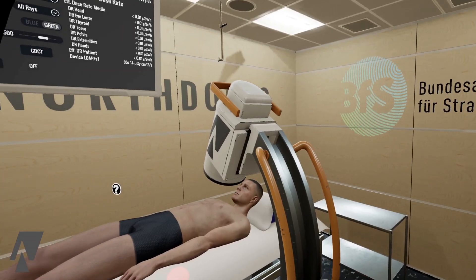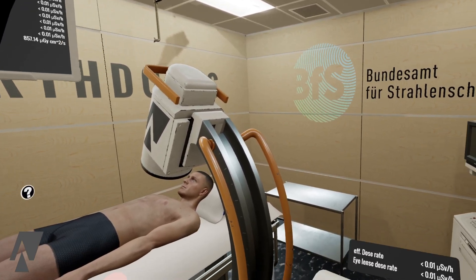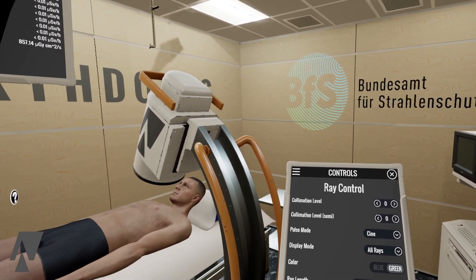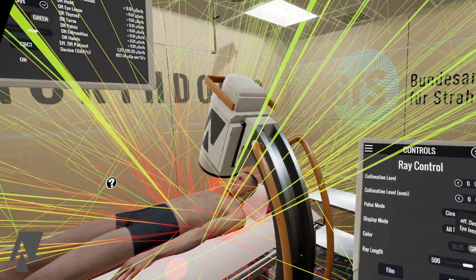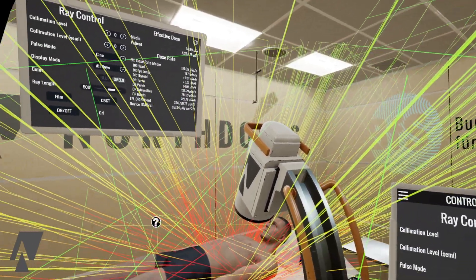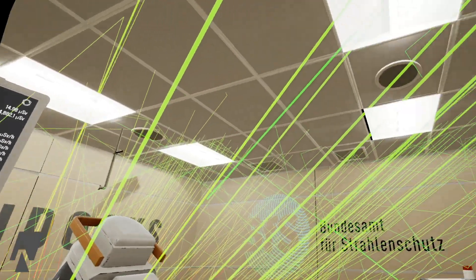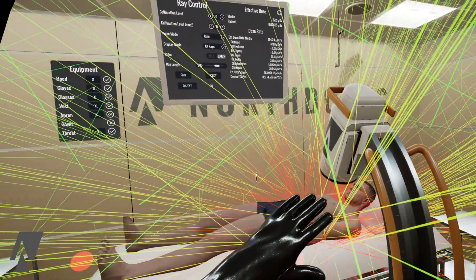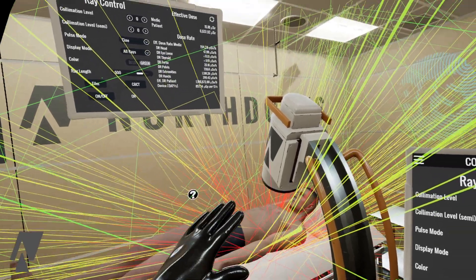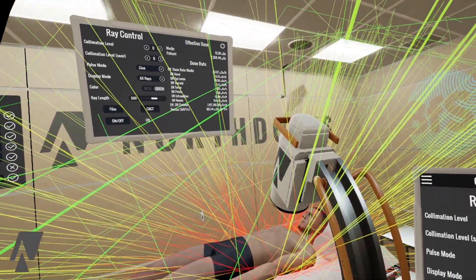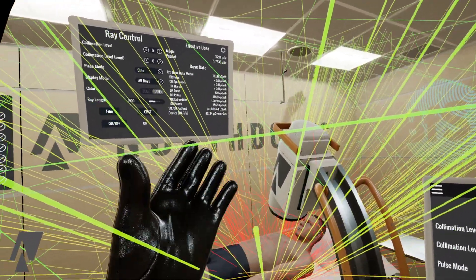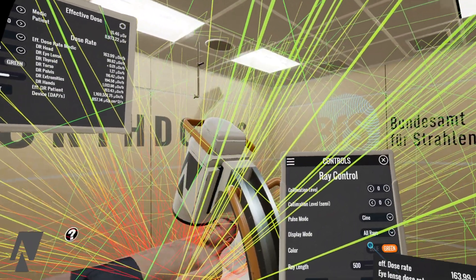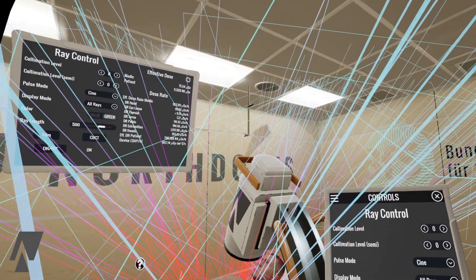Let's now work a little bit with the C-arm. Let's first bring up the controls panel and switch on the radiation. We can follow the radiation as it bounces through the room. It's also color coded — all the red lines are high energy and high risk, and the green lines are low energy, low risk. We can switch to blue coloration as well for people who are colorblind.